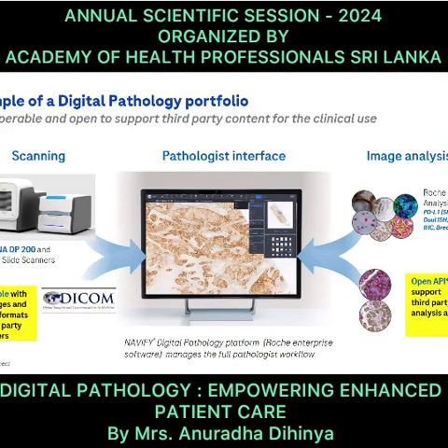DICOM format images can be easily integrated into the PAC server. Where radiology uses the PAC server, your digital images, if they are in the DICOM format, can be easily merged with that PAC server. So you have to consider whether your scanners have the DICOM format facility.